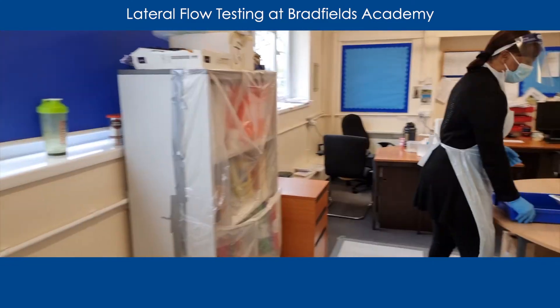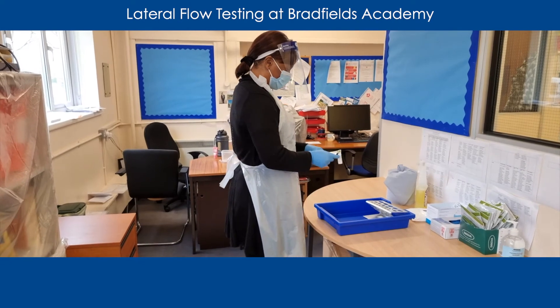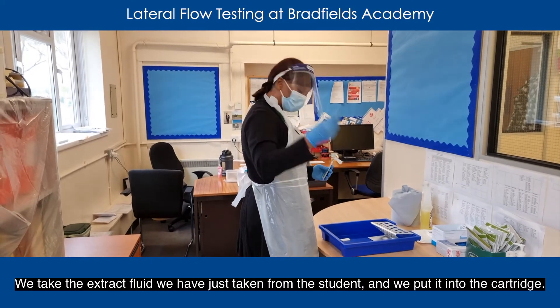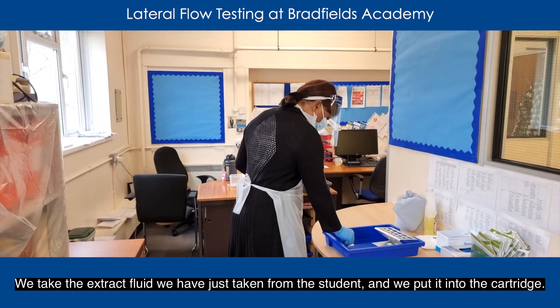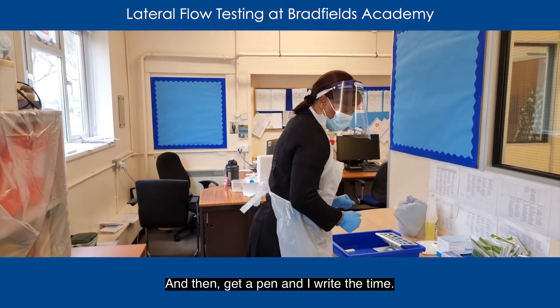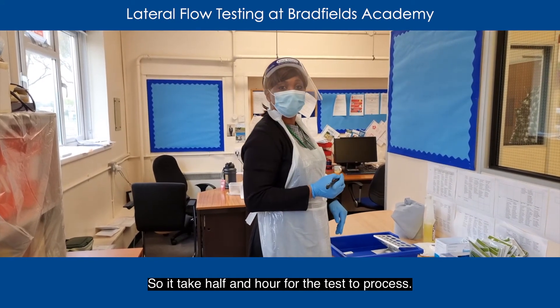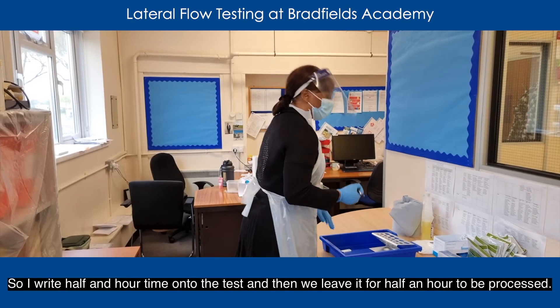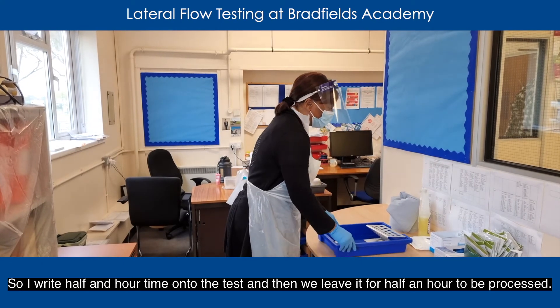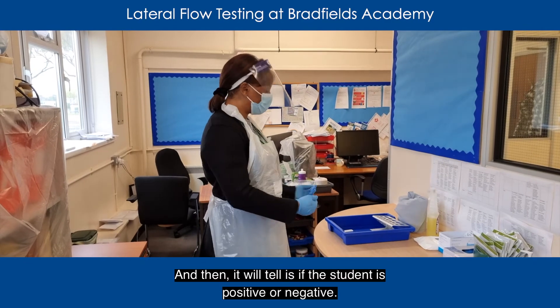Then we'll take it to the process bay where it will be processed. What we do is we open the cartridge, put the cartridge down, take the extract fluid we just taken from the student, and we put it into the cartridge — two drops. Then we get a pen and write the time, as it takes half an hour for the test to be processed. We write the half-hour time onto the test, leave it for half an hour, and then it will tell us whether the student is positive or negative.